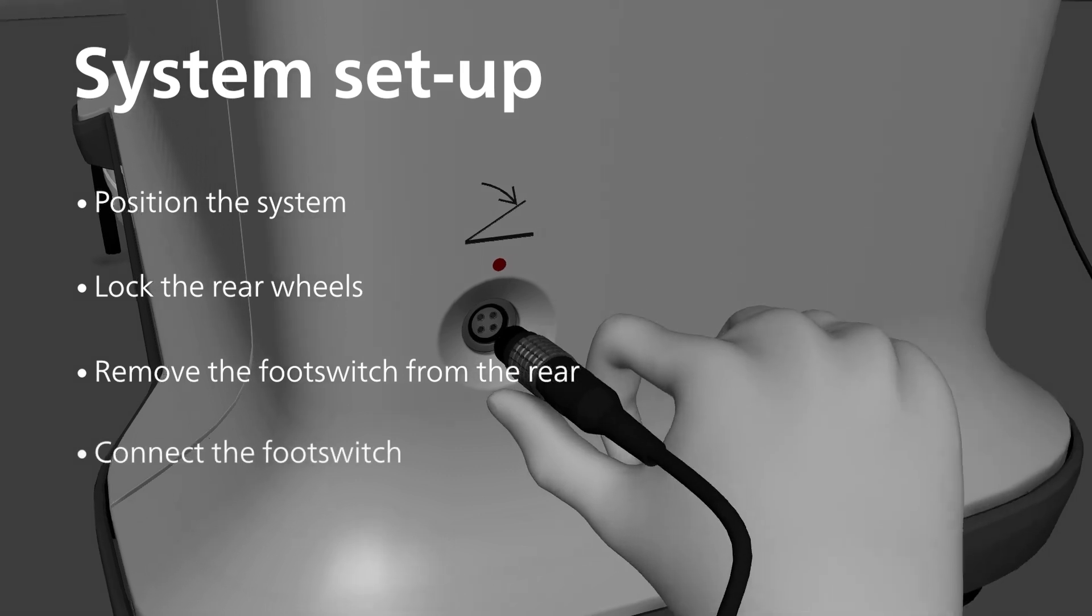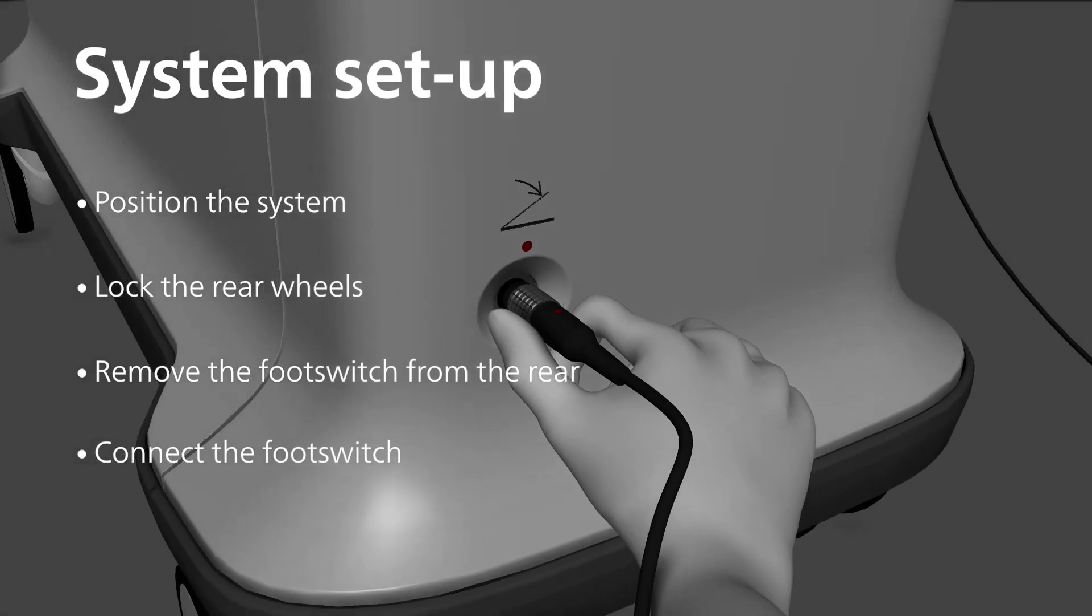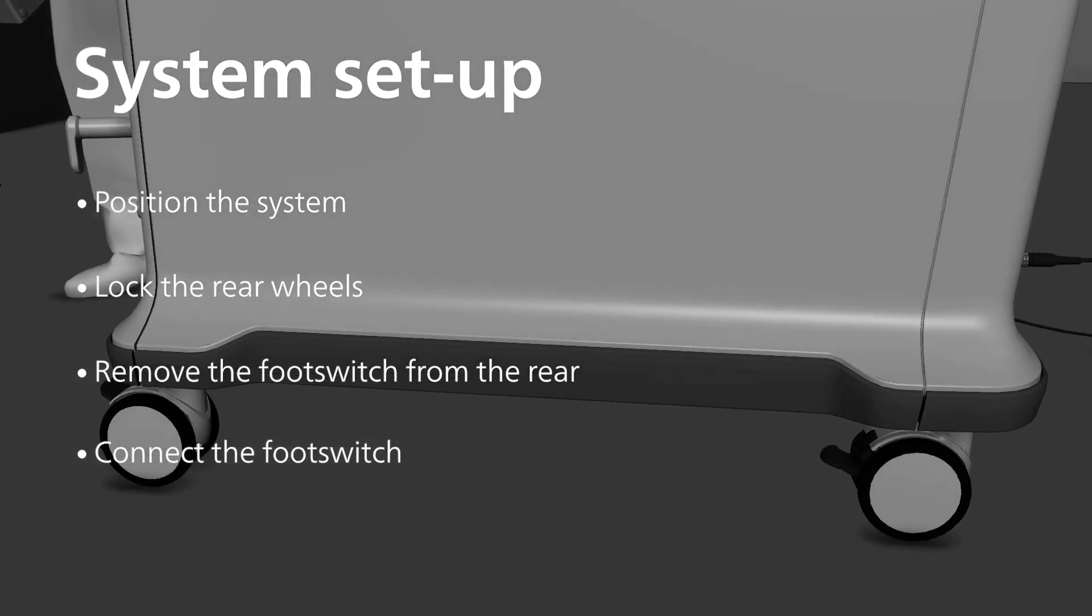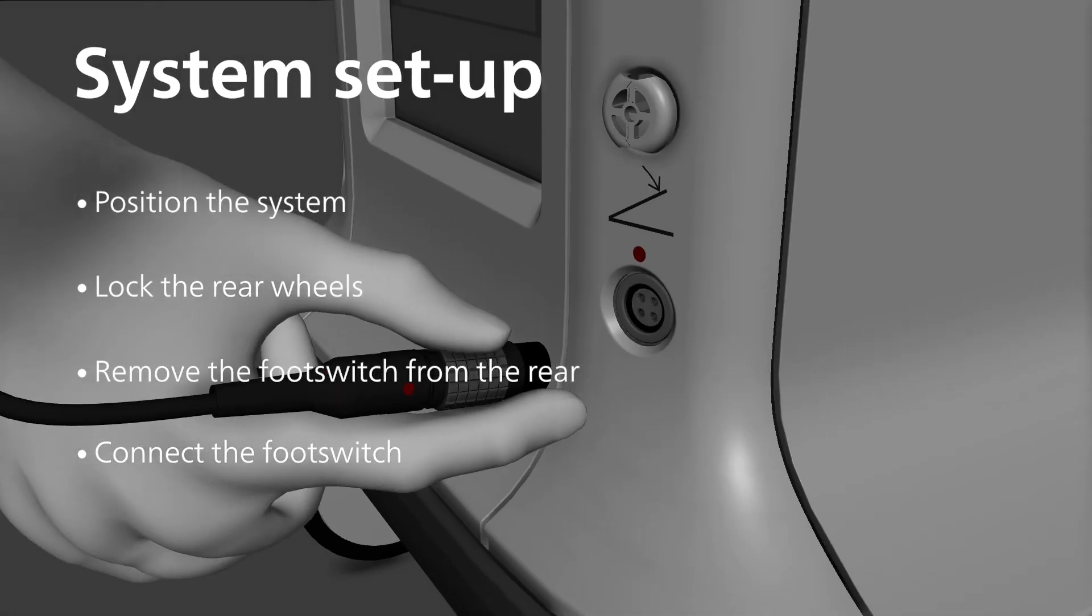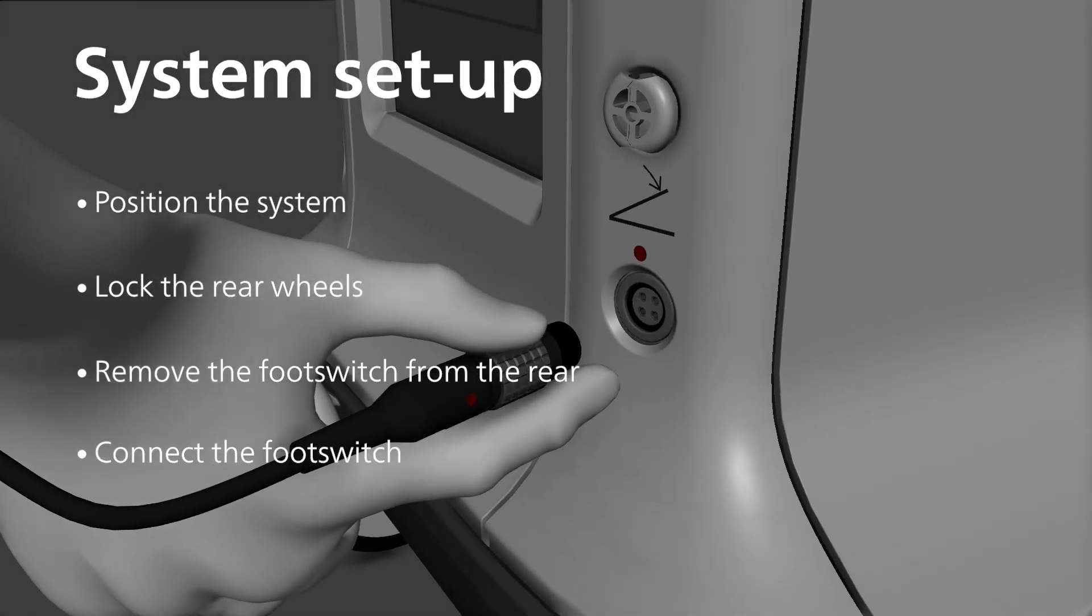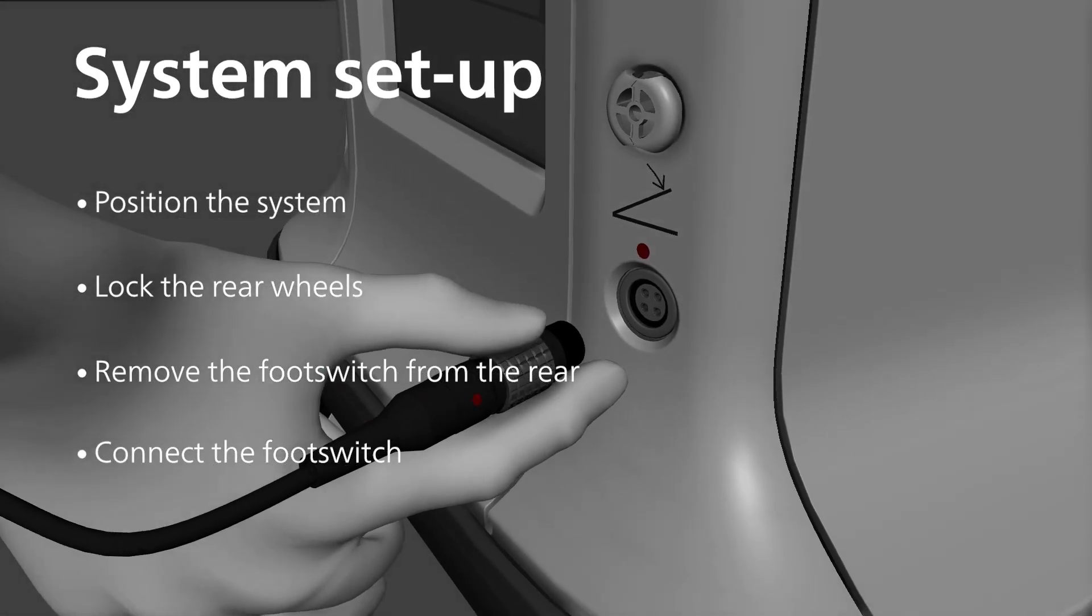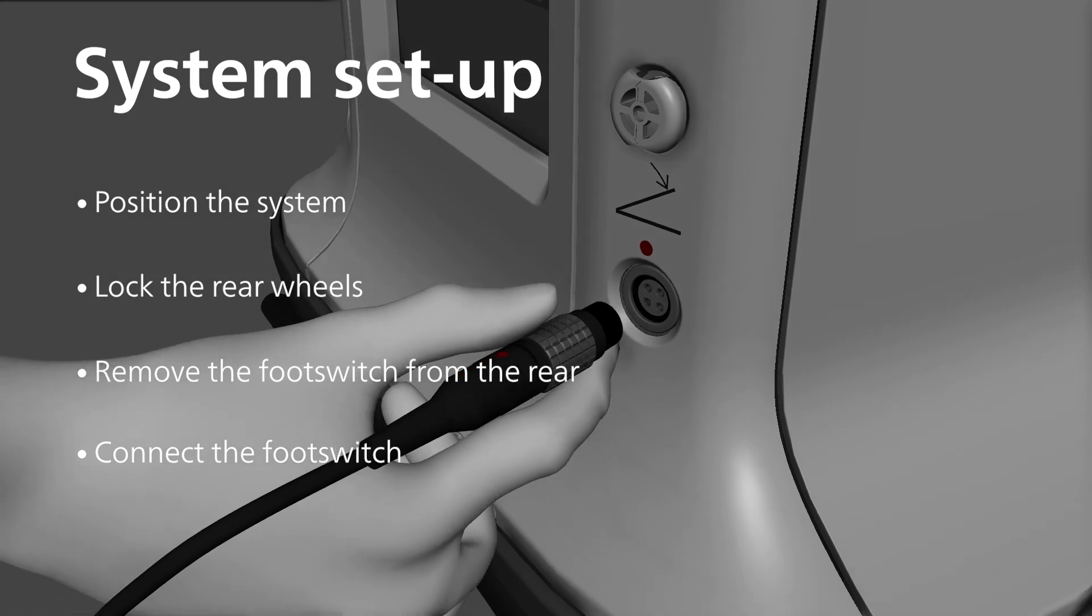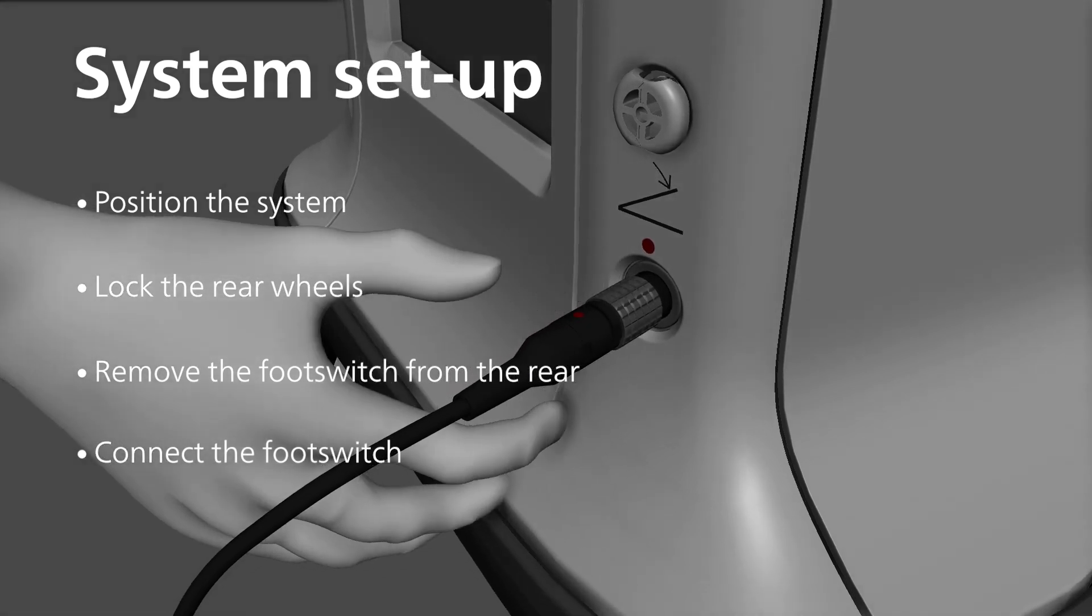To connect the footswitch, align the red dot on the plug with the red dot on the socket. There is a socket for a footswitch on both the front and the rear of the system, but only one footswitch can be connected at a time.